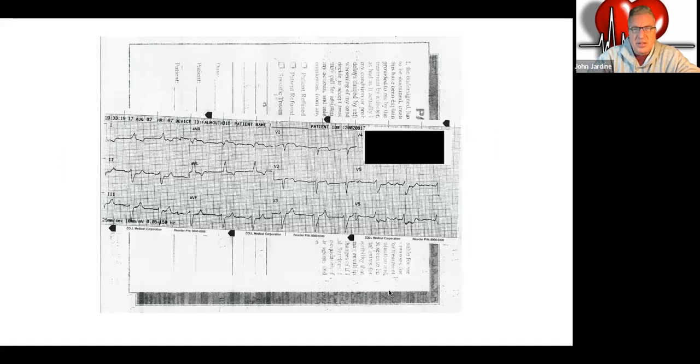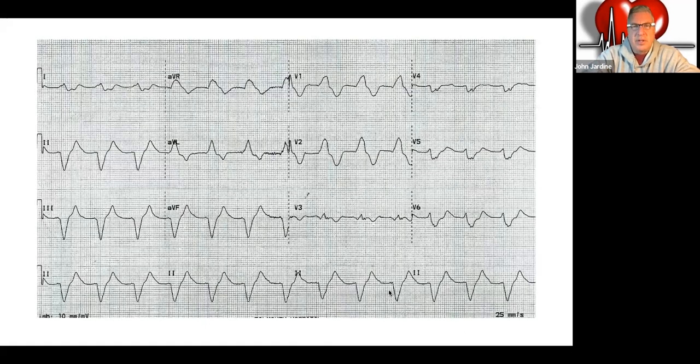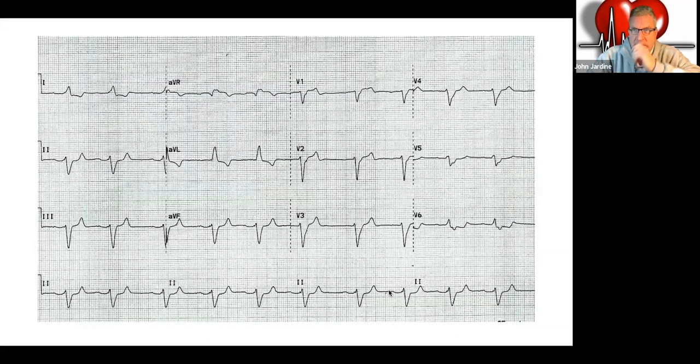Again, this is attached to the back of the PCR. This is his 12 lead. And you get a 12 lead in the ER that looks like this. I'll give you a minute to kind of digest that one. So that's his 12 lead. I can show you that he was given an intervention between this, and you can see the difference in the EKG there.